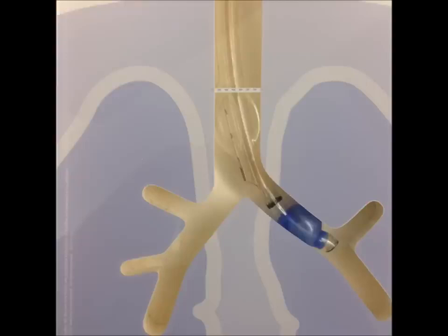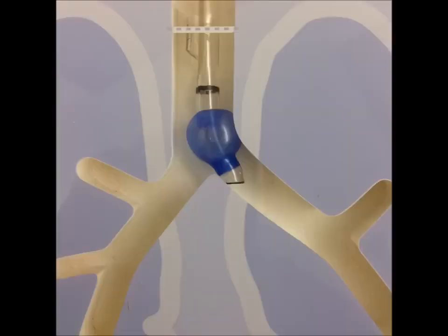So when you pass your bronchoscope down, you'll be able to see that. Here is an example of a tube which is herniated out completely, and you can't ventilate exclusively either side. Particularly if you've tried to ventilate through the tracheal port, you're going to get real high peak inspiratory pressures. If you're trying to ventilate just the left side, there'll be air moving through here, ventilating the right side, and you'll have a surgeon who will not be happy.